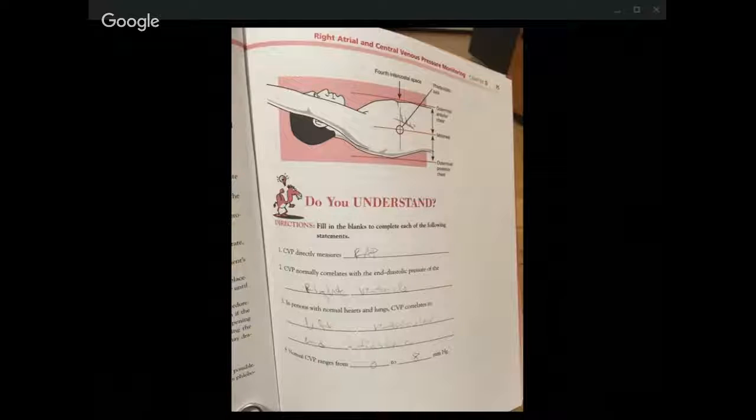What is the best position to have the patient in? Supine position. The zero level of a water manometer or the transducer should be placed where on the body? The transducer or zero level of the water line should be placed at the phlebostatic axis.